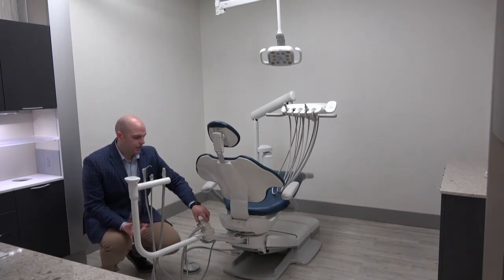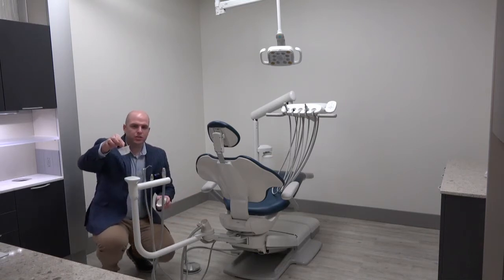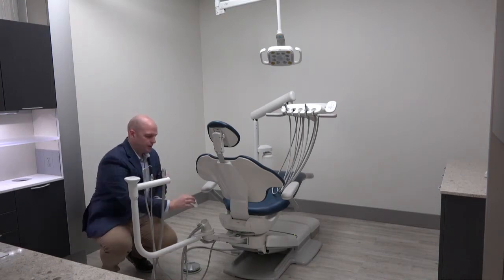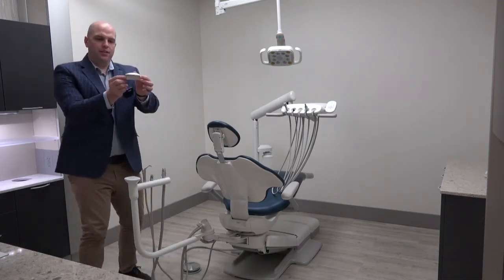The trap needs to be emptied frequently and is located right here. The top just pops off, and inside is a little basket which can be disposed of according to your office procedures and then replaced with a new one.